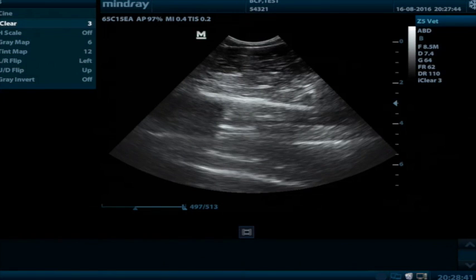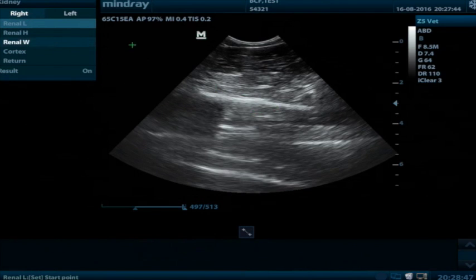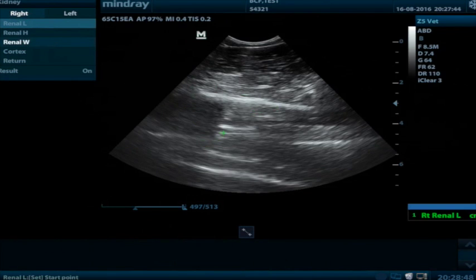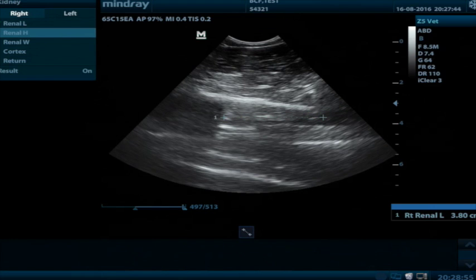We can use the rollable to choose kidney, and then we can choose renal length. When we're doing a length, the cursor will then turn into a cross, and we can set down using the set button where we want the length to start and finish. You can then see down in the bottom right hand side of the screen, it says right renal along with the measurement we've just taken.